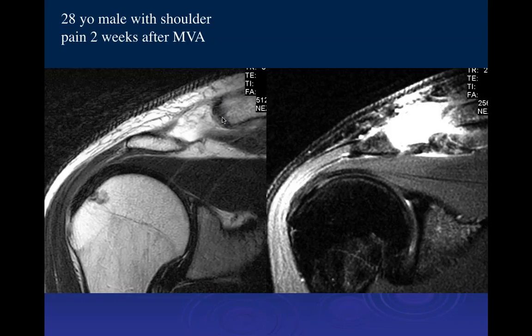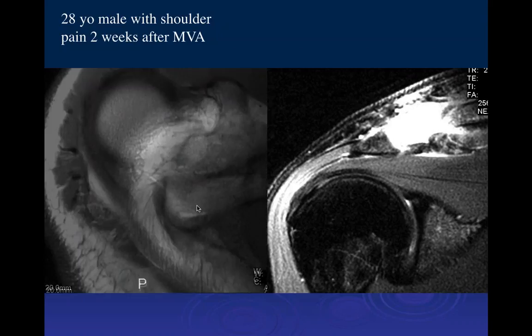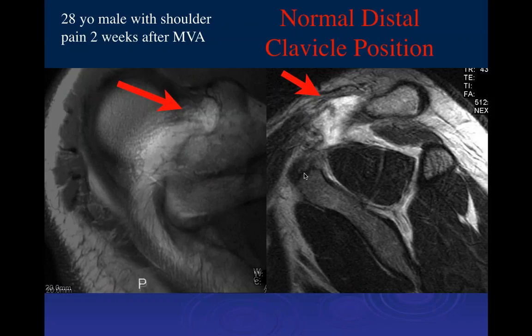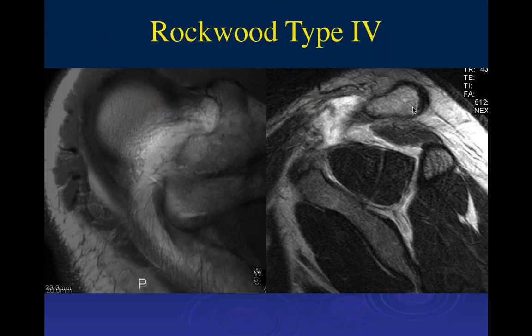The clavicle is now posteriorly dislocated rather than in its normal anterior position over the AC joint. The sagittal images confirm a tear of the CC ligament and show the clavicle displaced far posteriorly rather than in its normal anterior superior location.